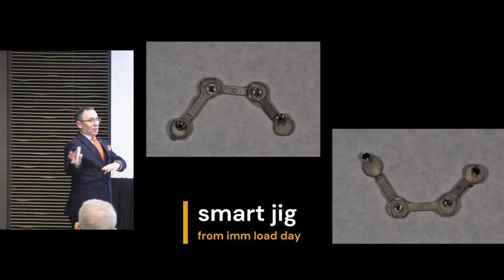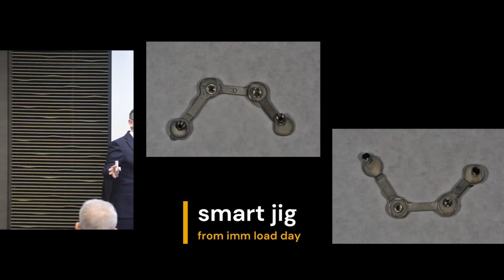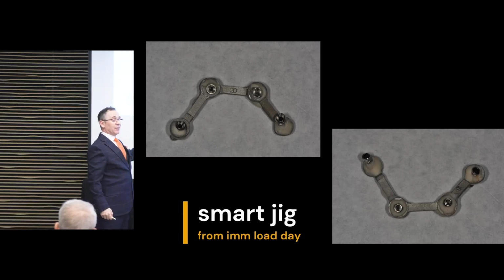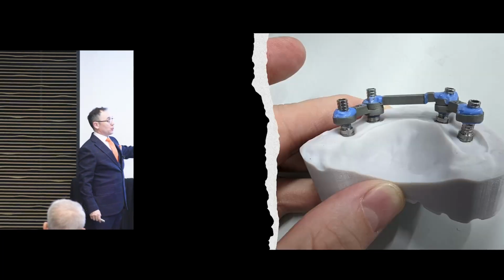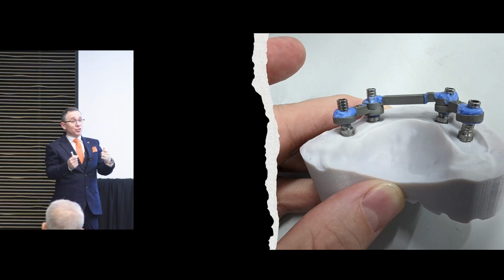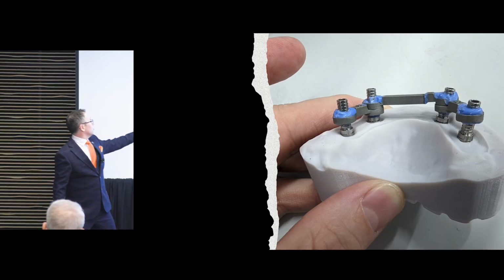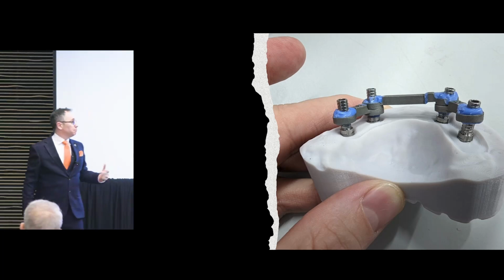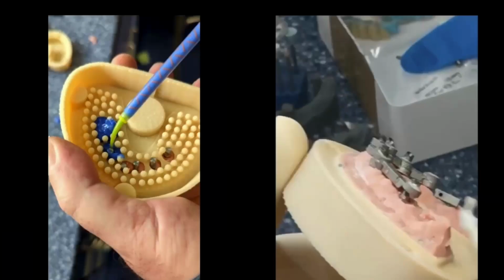And it's a shame that with Phil, he's been doing photogrammetry, amazing. So you could do that and just put them in. But if people don't have that and don't have a good way of getting an accurate scan, just do a metal jig and send it to your lab. Because this shows what was true in the mouth, the printed model isn't reproducing it. So back to you, Martin.